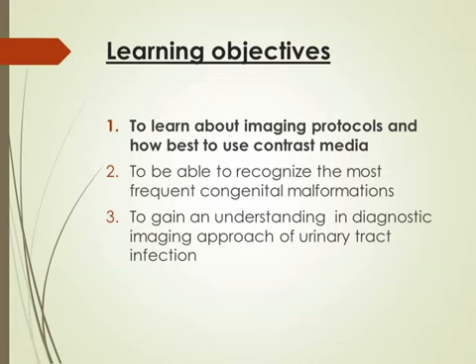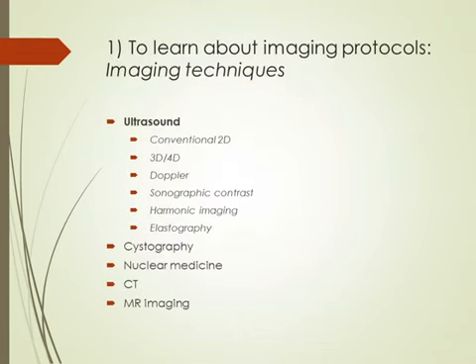So what are our objectives? We want to learn about imaging protocols. We want to be able to recognize the most frequent congenital malformations, and we want to gain an understanding of the diagnostic imaging approach of urinary tract infection. What are the techniques? There are many, and the first main message of this course is surely, as you can imagine, ultrasound.